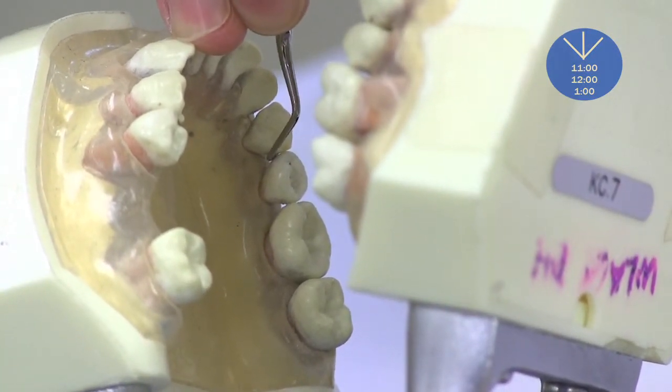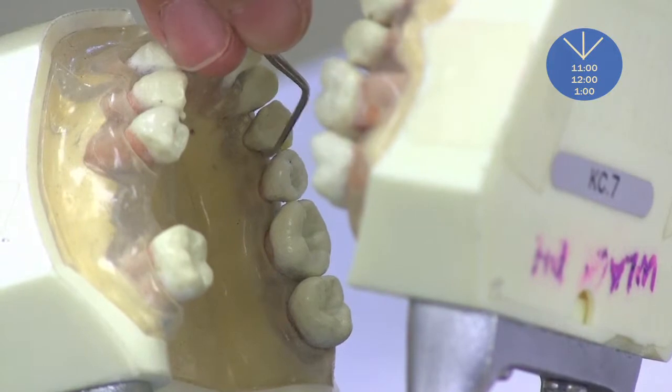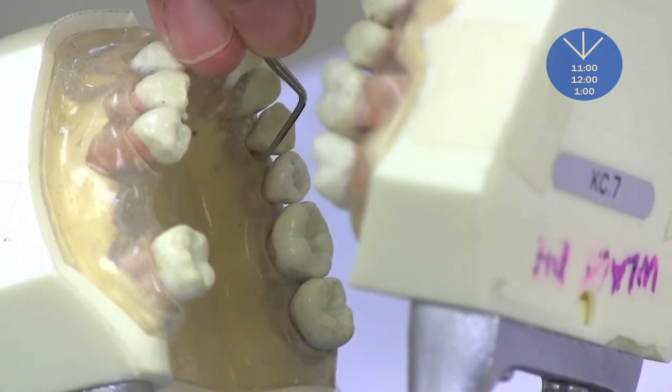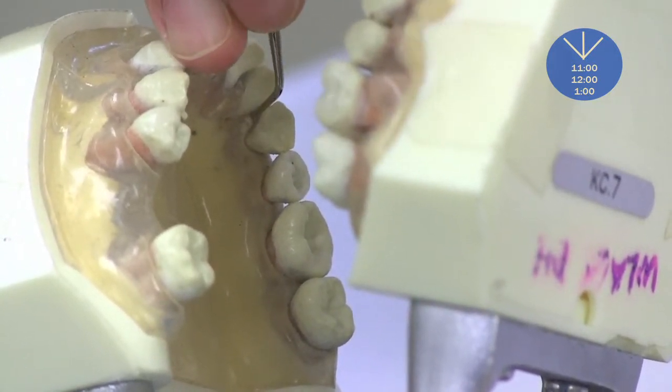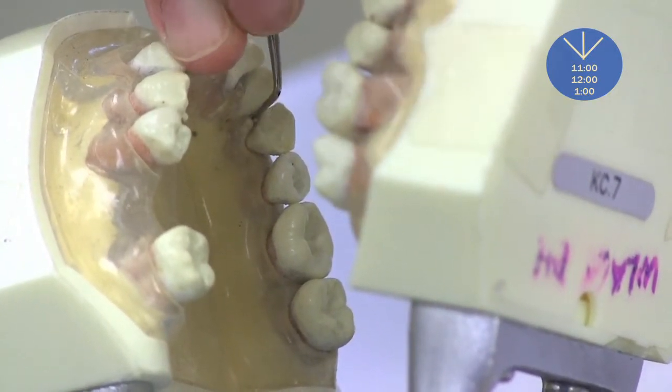Then straight lingual to the mesial, vertical, up and down.